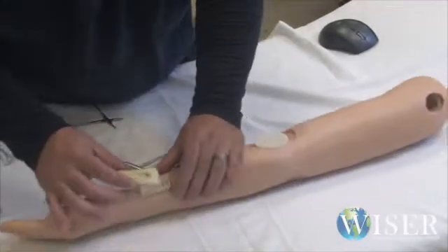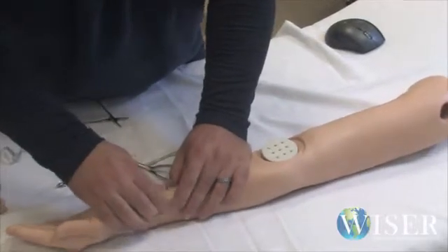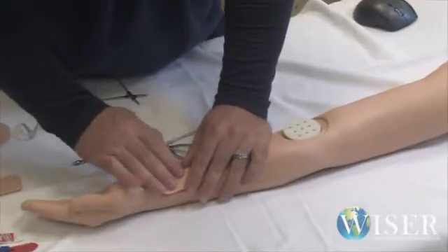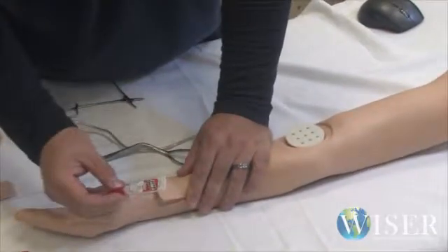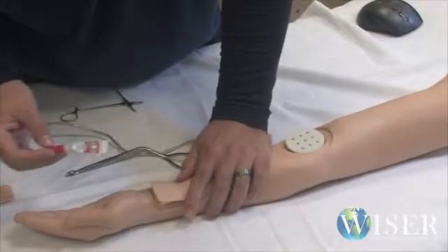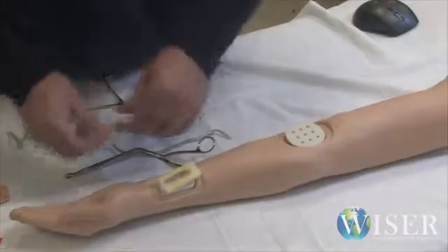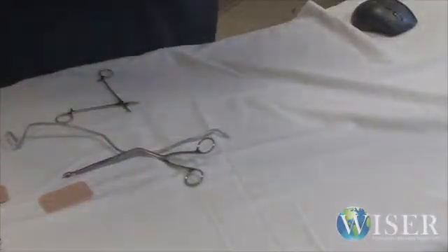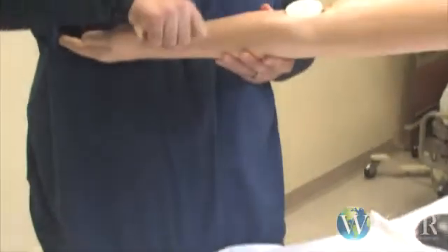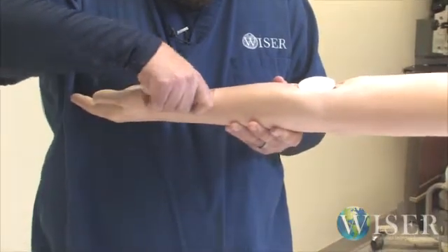The modules have these foam covers, which just lay like that. And our skin goes over top like that. So we want to use super glue on the skin. And you want to be very careful because, you know, the skin, you only get so many shots of doing this. So make sure your module is seated properly, not sitting on top of the wire because that'll cause it to push up and it won't fit right.